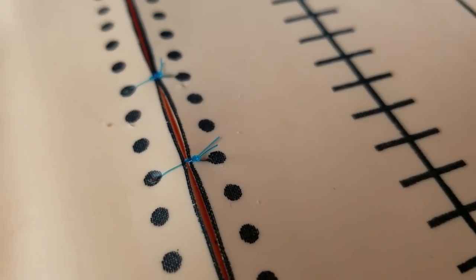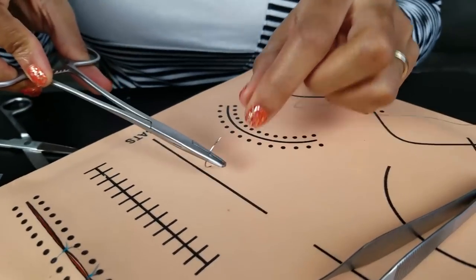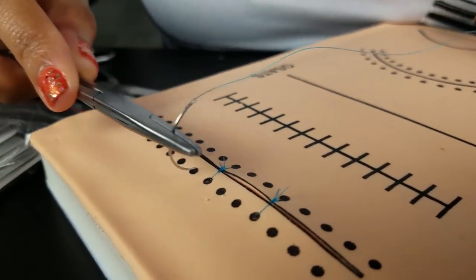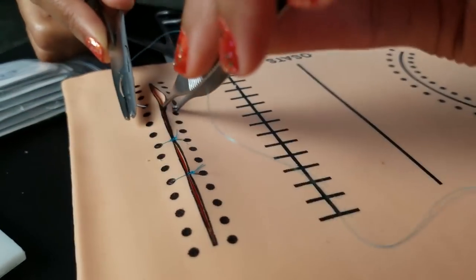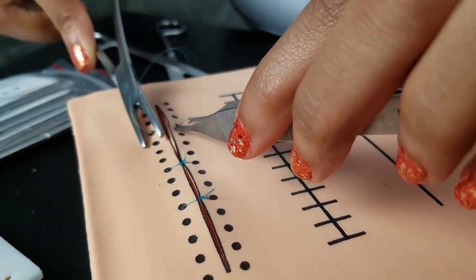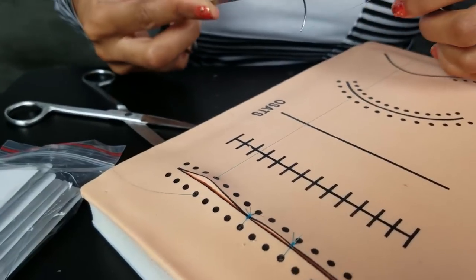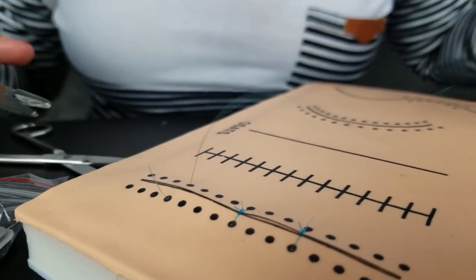And so again, you'll go in. We'll go in with the needle about halfway there. Again, split it down the middle. There we go. That's halfway. So this is a really good trainer to train on. The skin itself is tough, but it still has a lot of give, like the actual tissue that is supposed to be the skin. Okay, so I think I pulled it a little bit too much there.